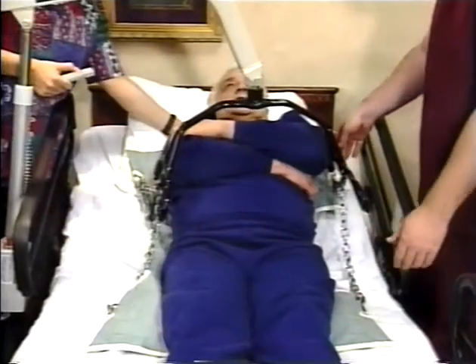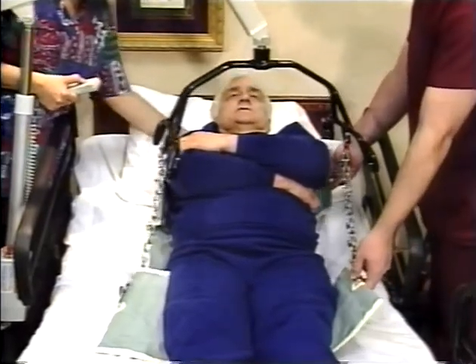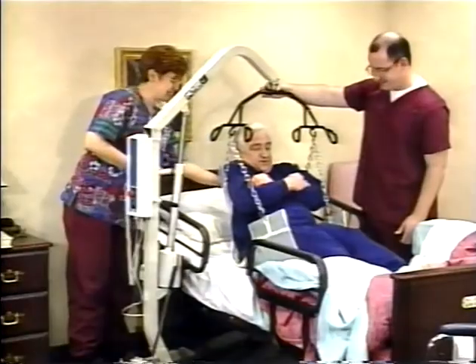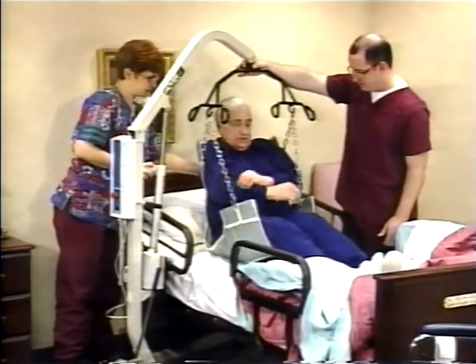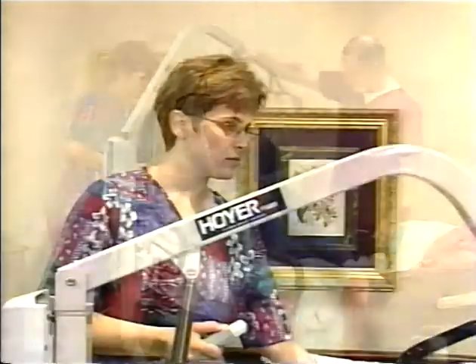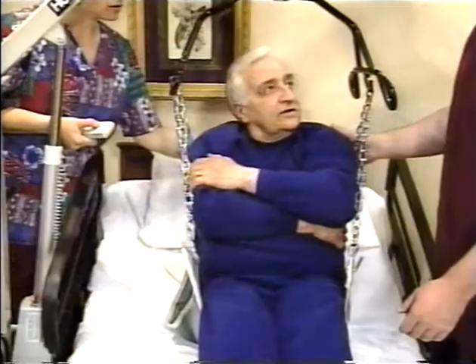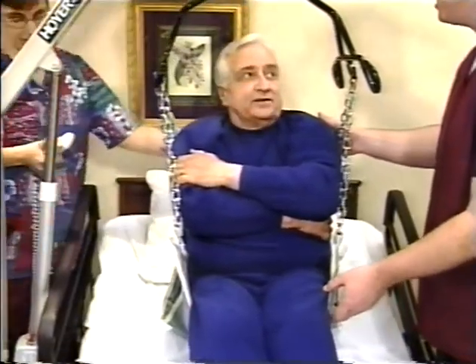Raise him only slightly and make certain that he's comfortable and correctly positioned. Raise him slowly until he's just clear of the bed. A self-leveling cradle will bring him into a sitting position. As one caregiver uses the controller to gently raise the passenger from the bed, the other checks to see that all loops are properly secured.